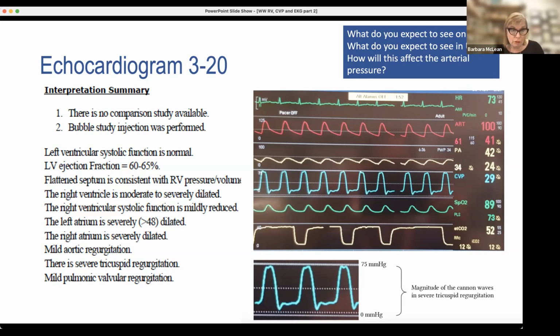And this is part of the reason that she lost consciousness. I believe this is a major part of the reason that the patient had a cardiac arrest. It's really important to investigate these things and not to just write numbers down, but to really look at what they're telling you. Now look at this again. Remember, this is not her. This patient had a PA catheter.